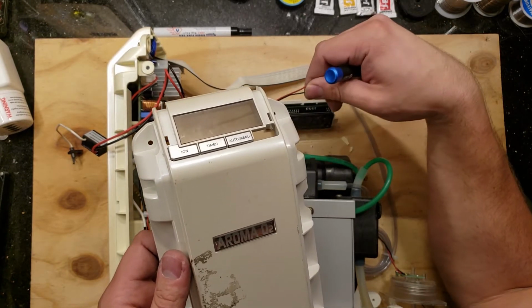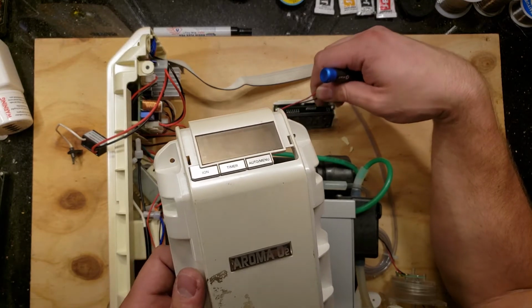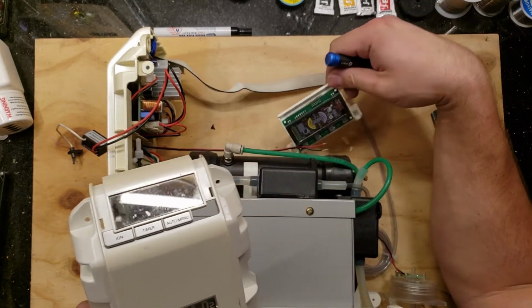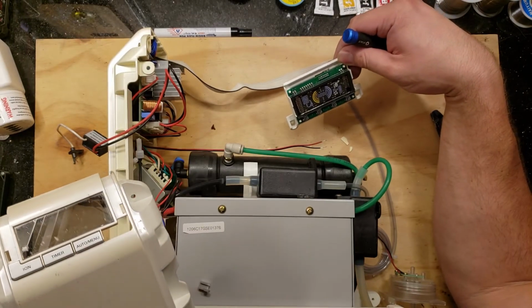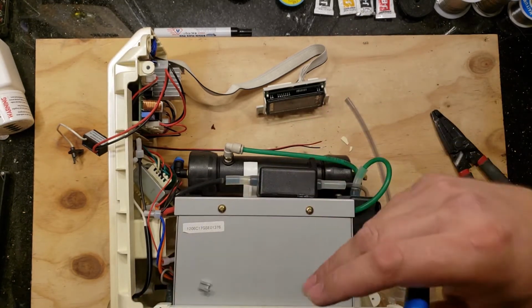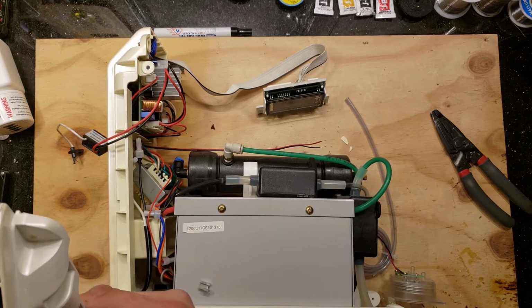So all this did was give you about 5 minutes per coin. The rest of the buttons didn't do anything. I tried pressing them, it would not do anything. I'll see if I can make them respond. I just gotta remember what order they were in so I can mess with it later.